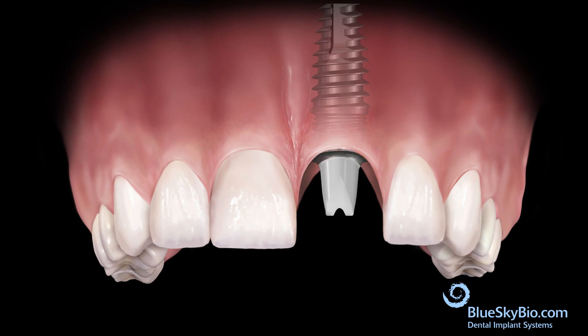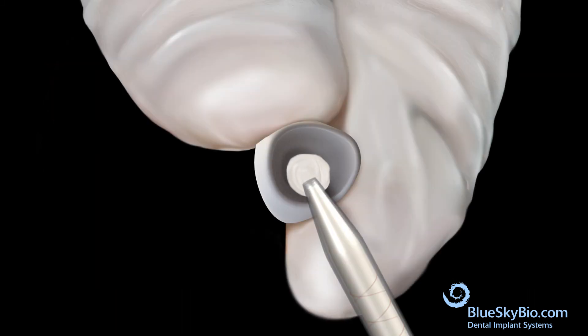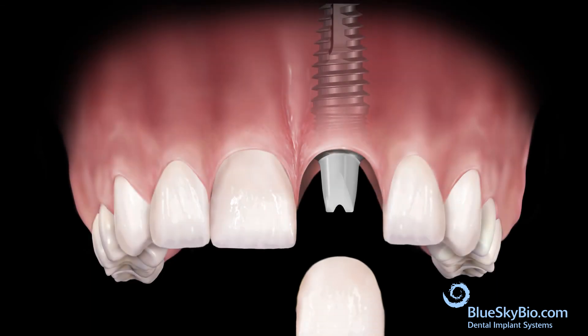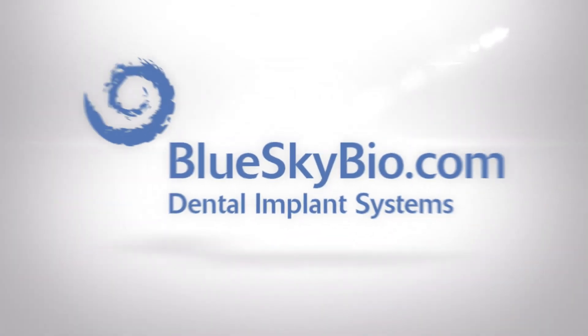Place the custom abutment in the mouth. Apply bonding material to the crown, bond the crown to the abutment, and remove excess bonding material.